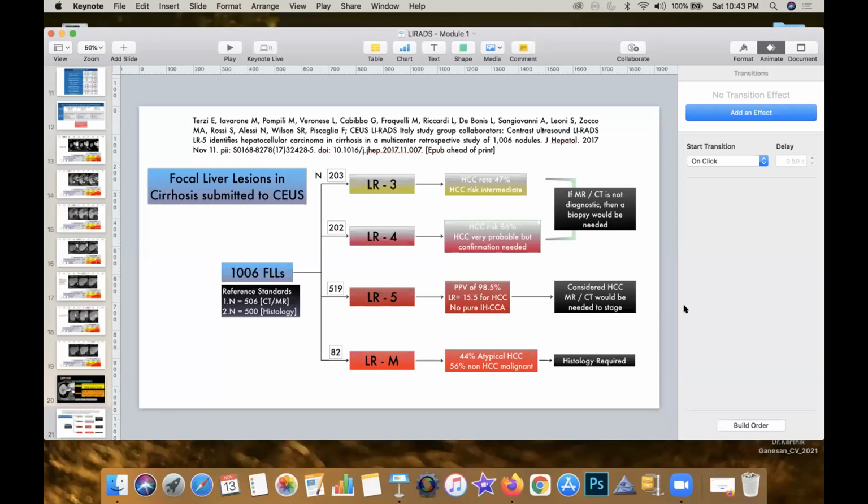Now, that peripheral nodular enhancement should coalesce, or aggregate together, and the contrast should start filling in centripetally. So the nodules which are enhancing will remain persistently enhancing. They will grow and increase in size, and the whole lesion will start to fill in. Typically it means the enhancement is there on the arterial phase, but there is no washout, only progressive enhancement.